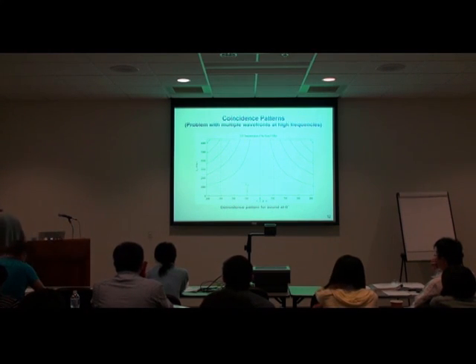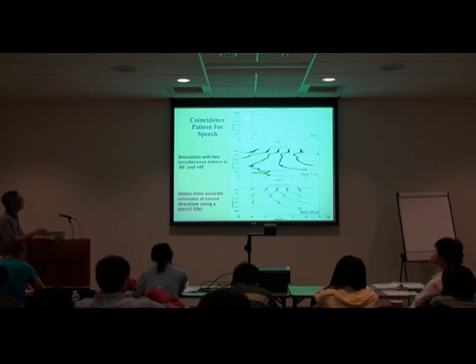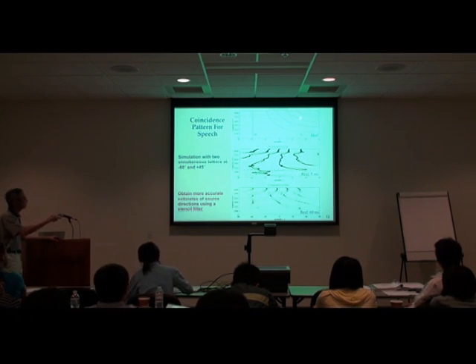An illustration of this is shown in the next slide. Here is a sound originating from 60 degrees to the right. You extract the coincidence pattern, and there is also a coincidence pattern from higher frequency.